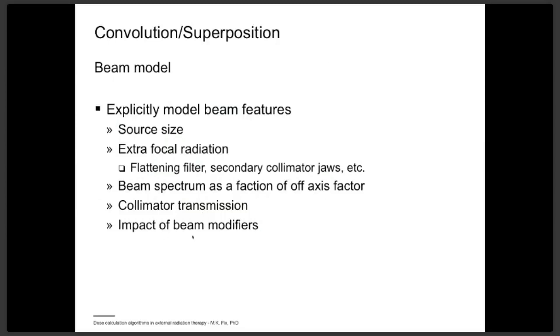Each of these impacts needs to be described, and the more precisely and accurately you describe those, the more accurate is your dose estimation in the patient representation afterwards. So errors at this level are propagated as systematic errors in the dose calculation.